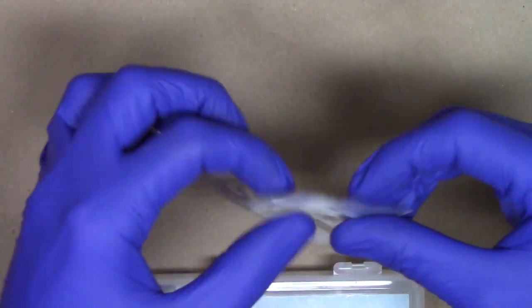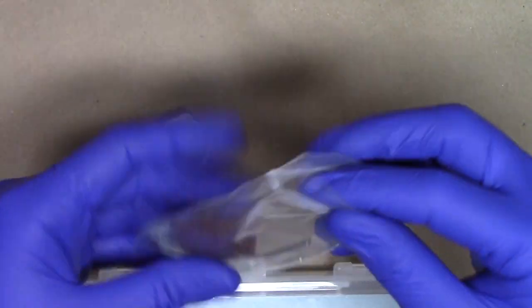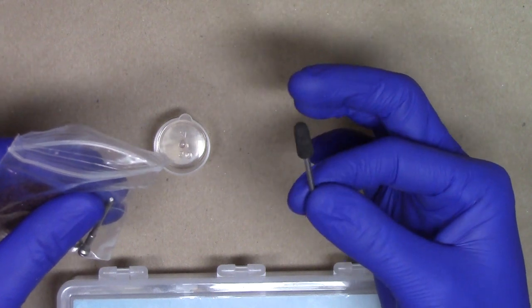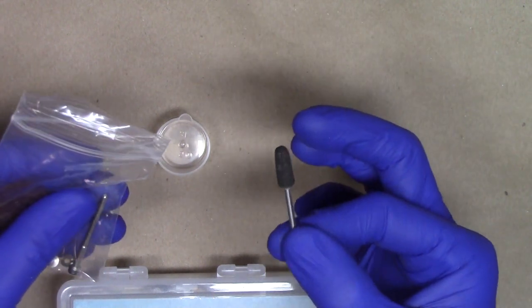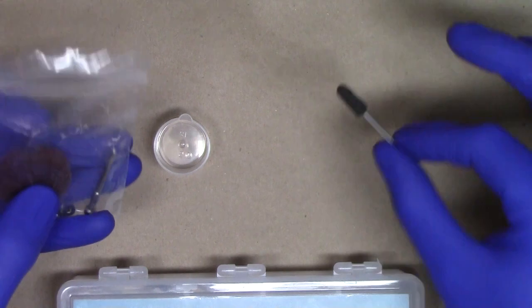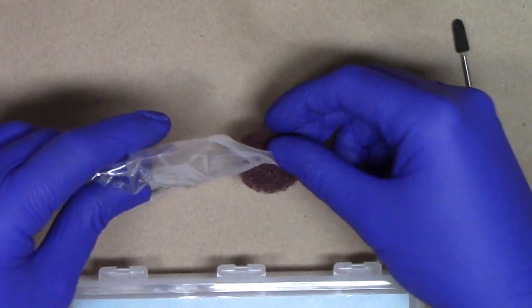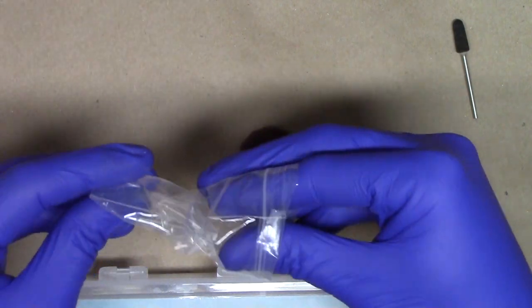And additionally, showing you inside of here is all of the finishing burrs that we would use. This is more or less just a coarse point. It's black in color, but this is what you will use initially. And then any of the finishing procedures will be done with this finishing wheel.